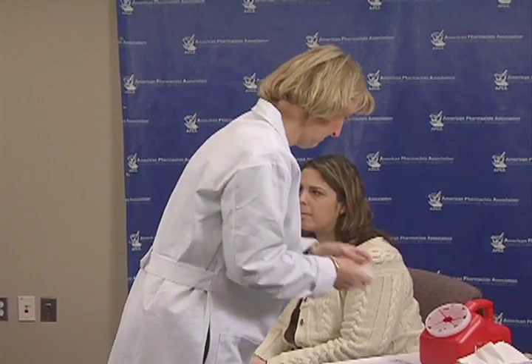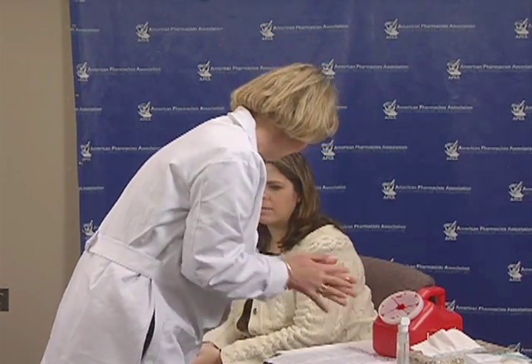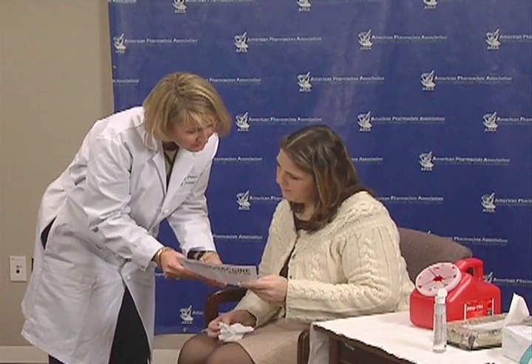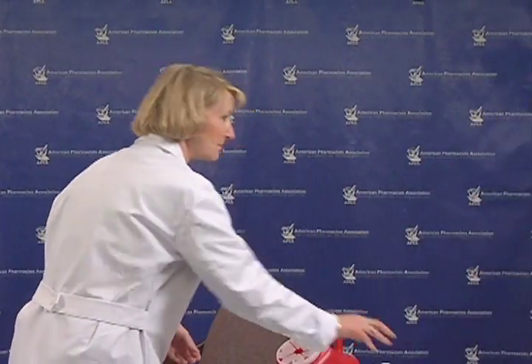Remove your gloves and wash your hands. Clean your workspace. Provide your patient with post-delivery counseling and follow-up instructions. Document the immunization given while maintaining compliance with all legal requirements. If the vaccine given was part of a series, you may want to consider scheduling your patient for the next injection needed.